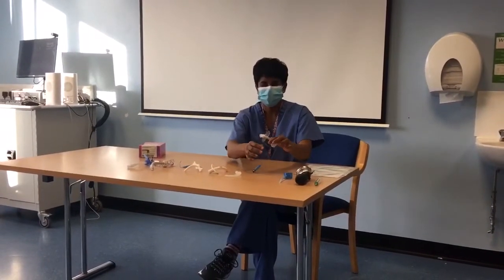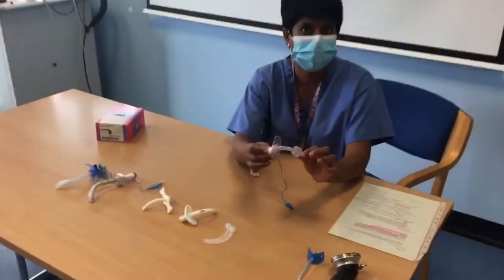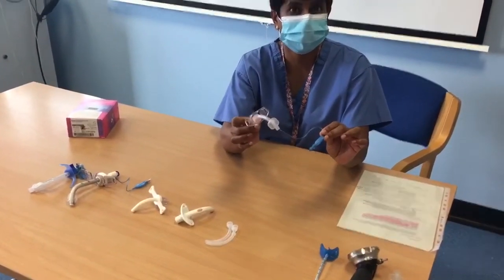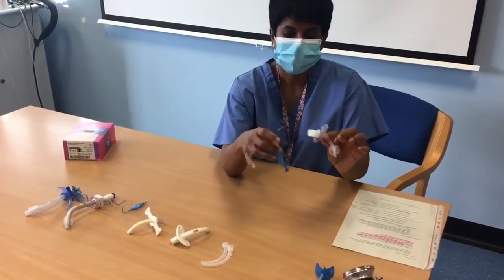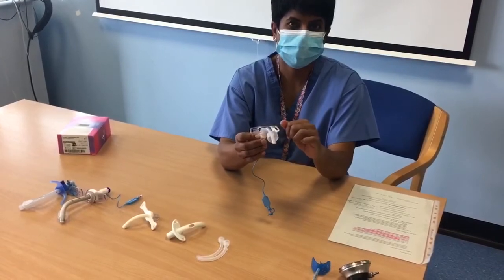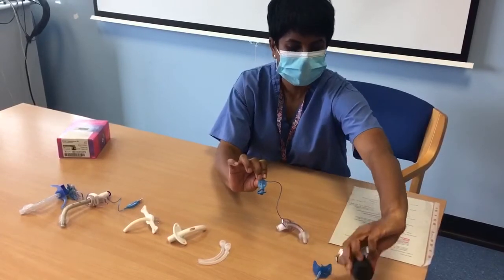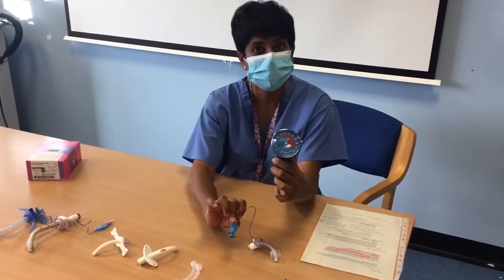Okay, second tube we'll look at is our Portex tubes. These are the more common tubes that you'll see certainly in critical care and accident and emergency. These can be done in the department. The patient doesn't need to go to theatre for these tubes to be inserted. As you can see, this has a pilot balloon which will inflate the cuff of the tracheostomy tube. The size of the tracheostomy tube is on the pilot, and through the pilot balloon we would use our manometer to make sure that the correct pressure is in the cuff.